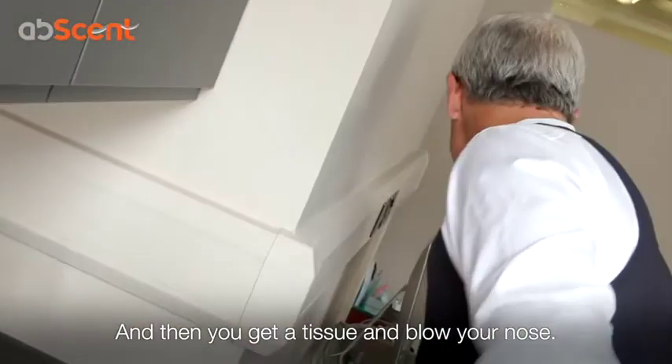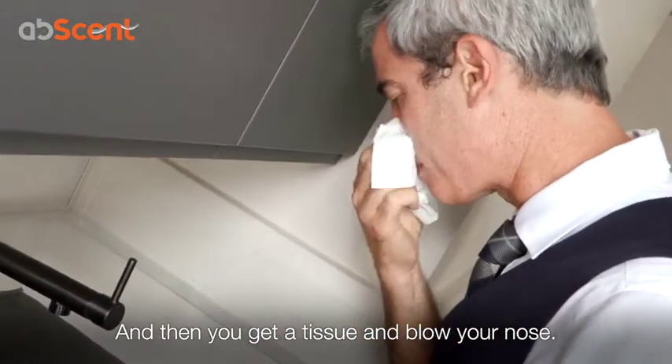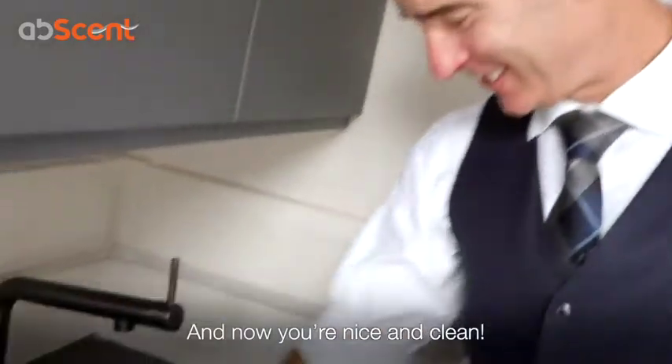And then you get a tissue, blow your nose, and now you're nice and clean.